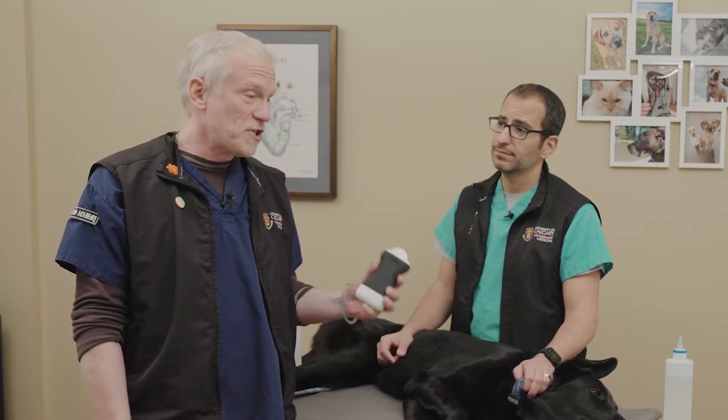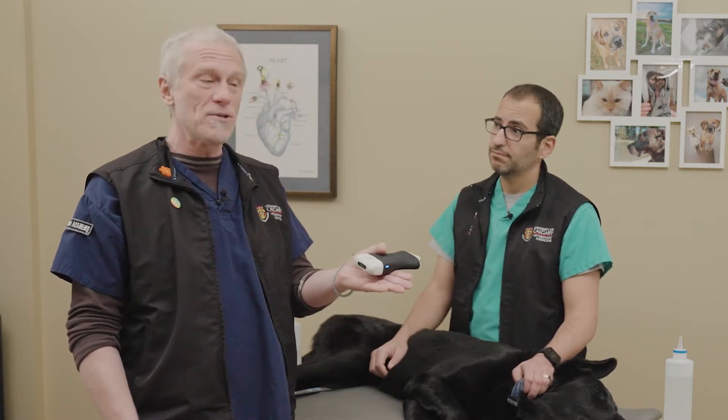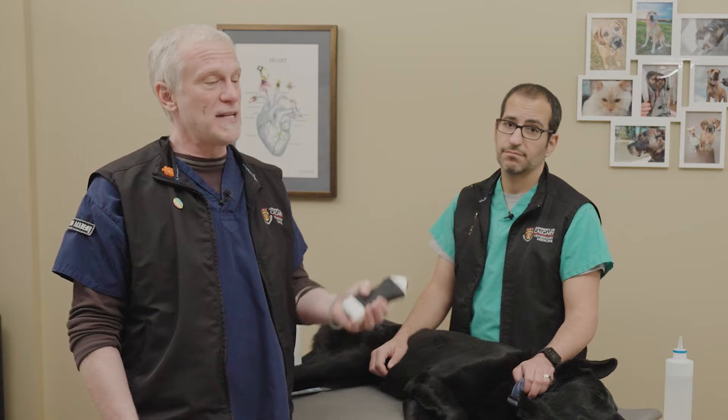It's important to give some key concepts about PLUS scanning. On the Clarius, the settings we use for pleural space and lung ultrasound are different than the abdomen. We have a lung preset that sets us up at six centimeters depth to start with, depending on body condition score of our patient, and we'll make any fine adjustments as we go along.